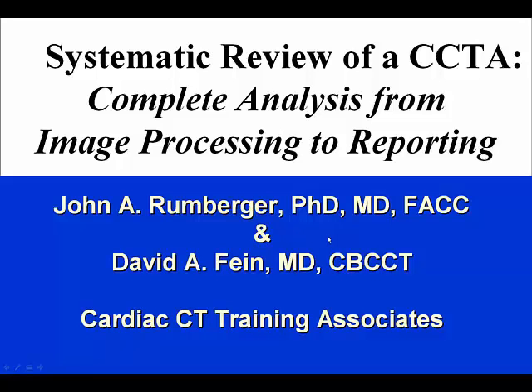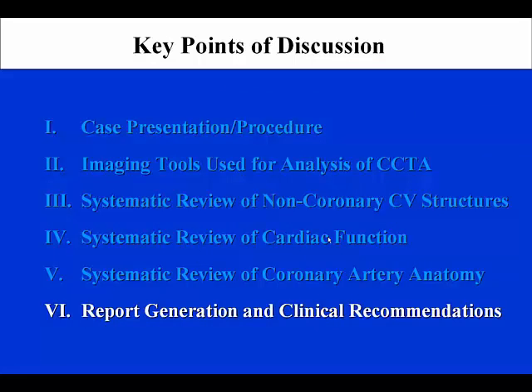Welcome to Cardiac CT Training Associates, systematic review of cardiac CTA, complete analysis from image processing to reporting. This is the third and final module regarding report generation and clinical recommendations.